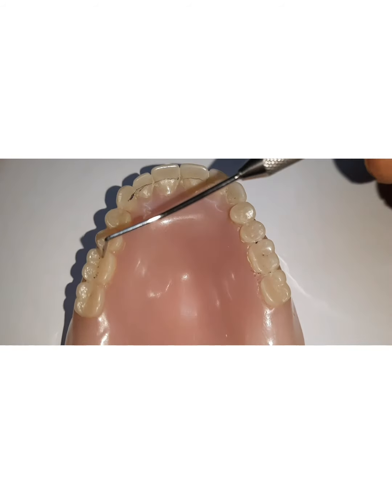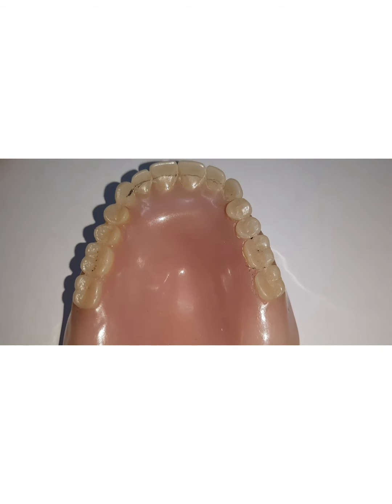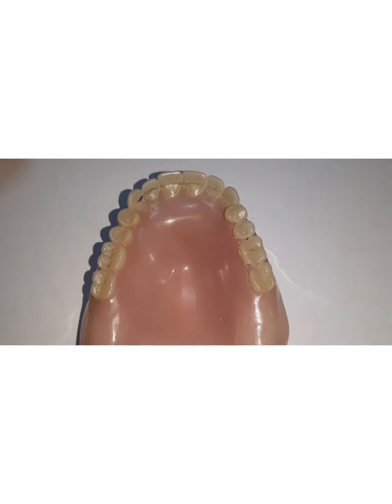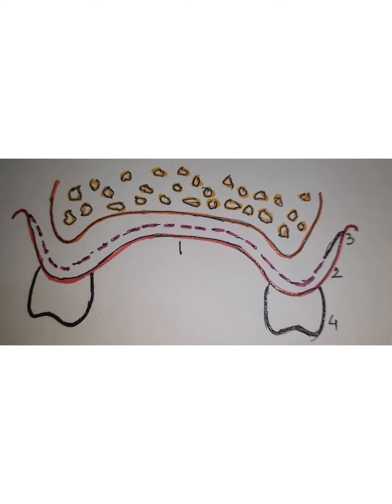So this which you see all around is the occlusal surface of the denture. As we can see, this surface consists of denture teeth, which simulate the natural teeth and cusps and act as sluiceways to help in masticatory function.